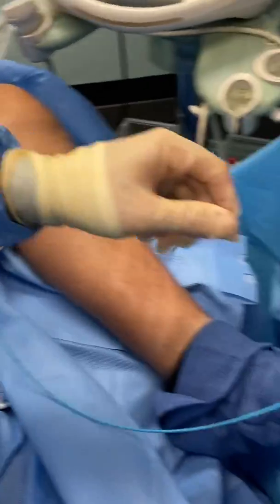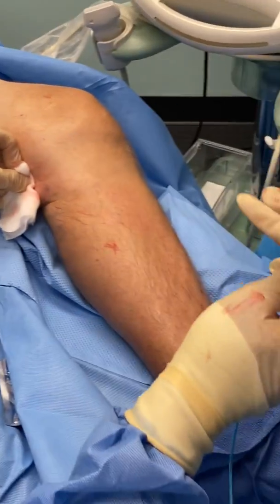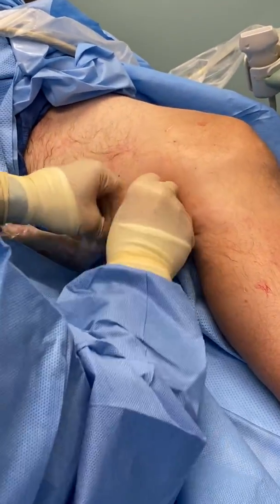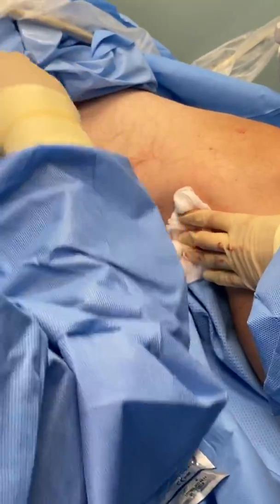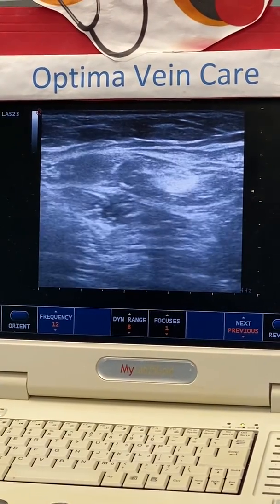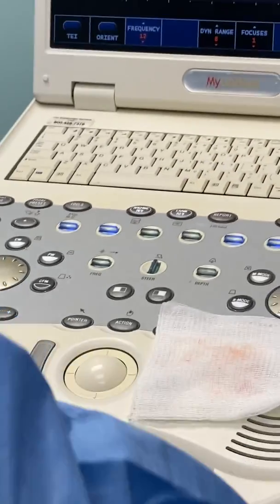So I'm going to show you what we do — we typically want to make sure that the glue doesn't go into the fem vein, so we pull this little inner catheter inside the outer sheath; that way it pulls any glue, and then we pull the catheter out afterwards. There we go. The procedure is basically finished — all we have is this tiny spot here; we're going to put a little steri-strip on it. I want to show you on our ultrasound the vein we just treated. This is the glue in the vein — if you go all the way to the junction, the glue starts about three centimeters back, and you'll see the vein is closed right there — the procedure worked perfectly. The vein is closed all the way down from there. So how do these veins get closed? The valves inside the veins fail.